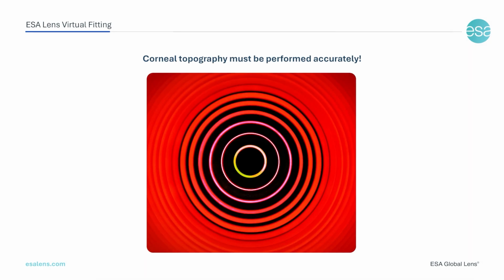It is important to remember that corneal topography must be performed accurately, complying with several conditions that we will discuss below. Otherwise, the likelihood of virtual fitting errors increases.